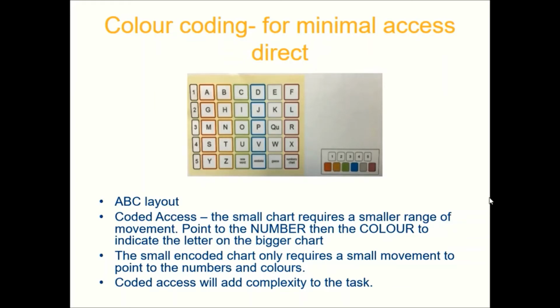So that's quite clever. As you can imagine, it takes quite a lot of cognitive load and learning. So do make sure your client's able to cope with that. But once it's set up, it works really well. And you can see the spacing difference between someone having to use all of that left side page to physically point to the letters compared to that little space in the bottom right, just having to move their finger a little bit as the key. So that might be something that works for your clients.